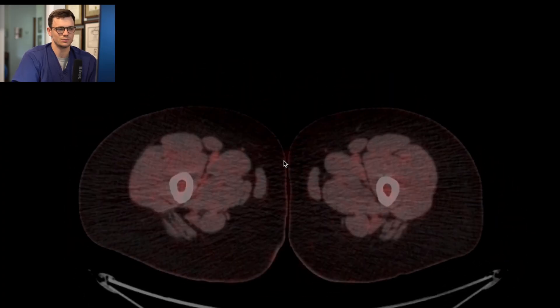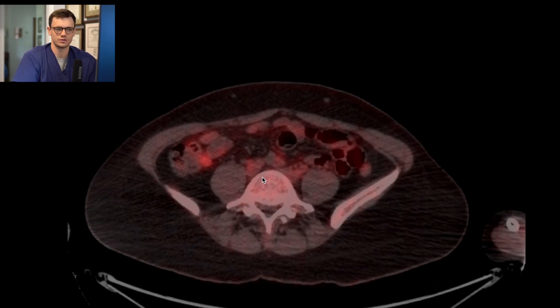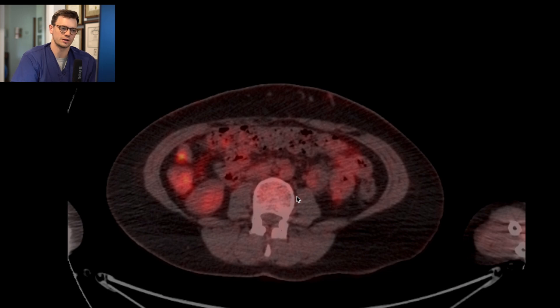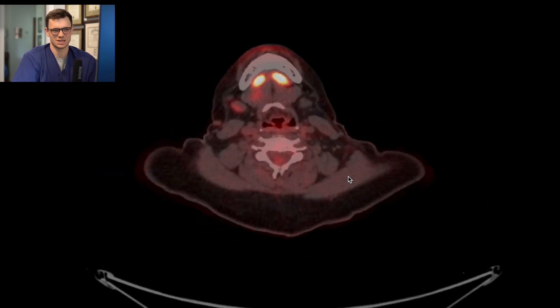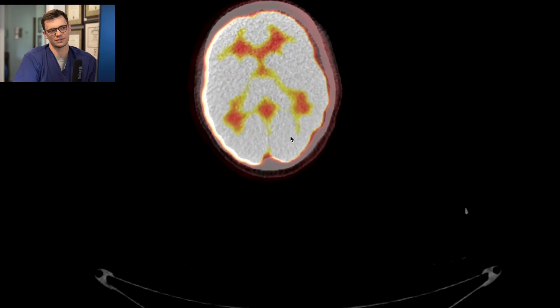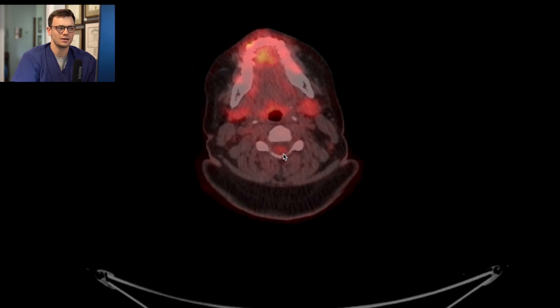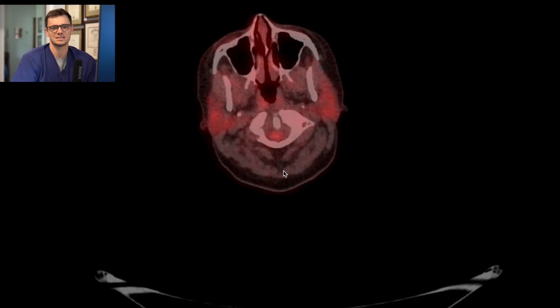Then I look at the bones, which is a little tedious. I go from inferior to superior and look at all the bones individually — the spine. I pull up the sagittal reformat and look at the spine, making sure I'm not seeing anything focally hot. Then I track all the ribs, which takes some time. I'm looking at the humeri, scapulae, clavicles, and don't forget the skull — you have to go all the way to the top. After that, I look at the CT alone without the PET images to look for any incidental findings. Sometimes you can see inflammatory things like diverticulitis, appendicitis. I've had patients with pneumothoraces on these scans. All of that needs to be addressed after you do the PET cancer follow-up work. So that's a normal study.